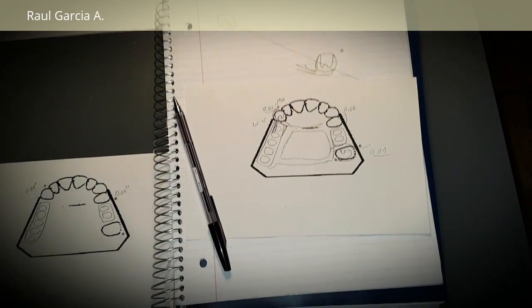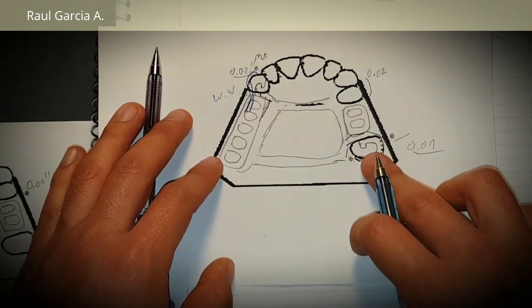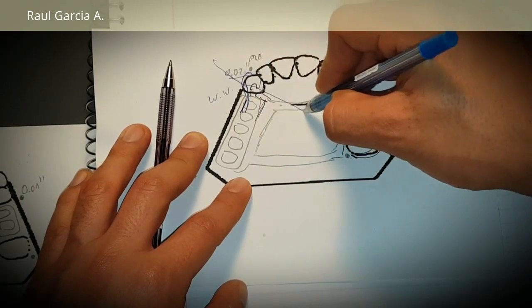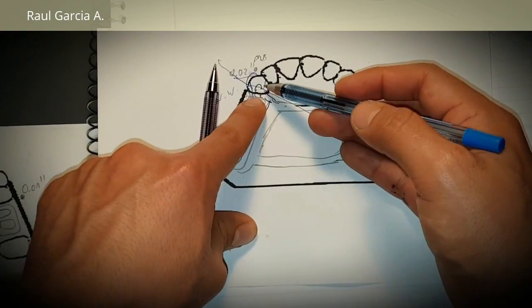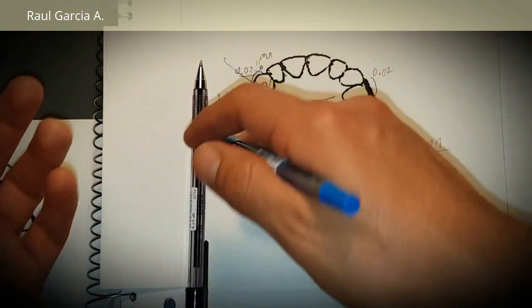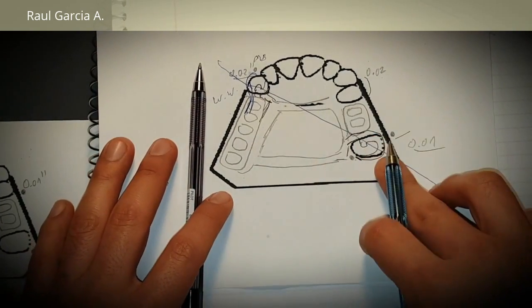So like that, you can see we have our wrought wire, and we put our back action here, and now we have our fulcrum. We see the line of fulcrum from rest to rest. Now you ask, why did you put the rest on the distal here? Because it doesn't matter, it's wrought wire. You can put it on the distal or the mesial because it's flexible. It's not going to damage the tooth. That's why. Okay, that's the exception. Nice. And now you have this.